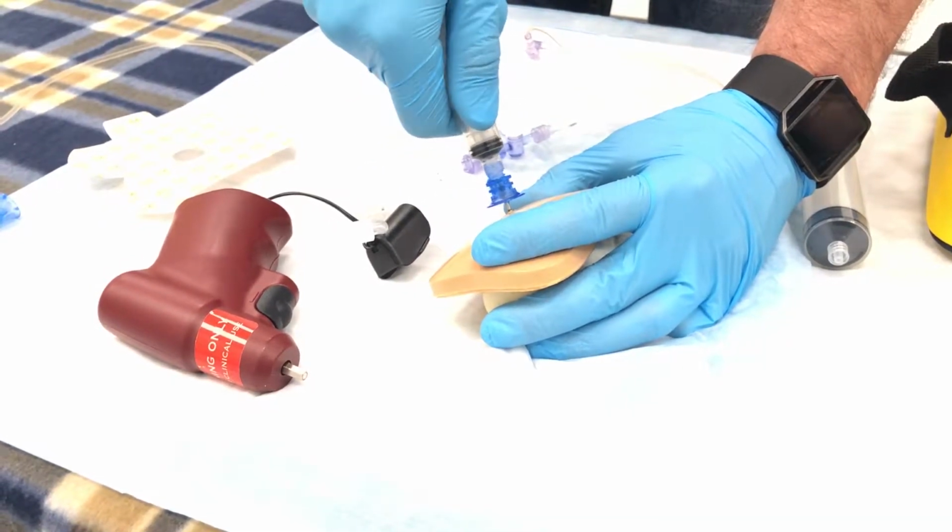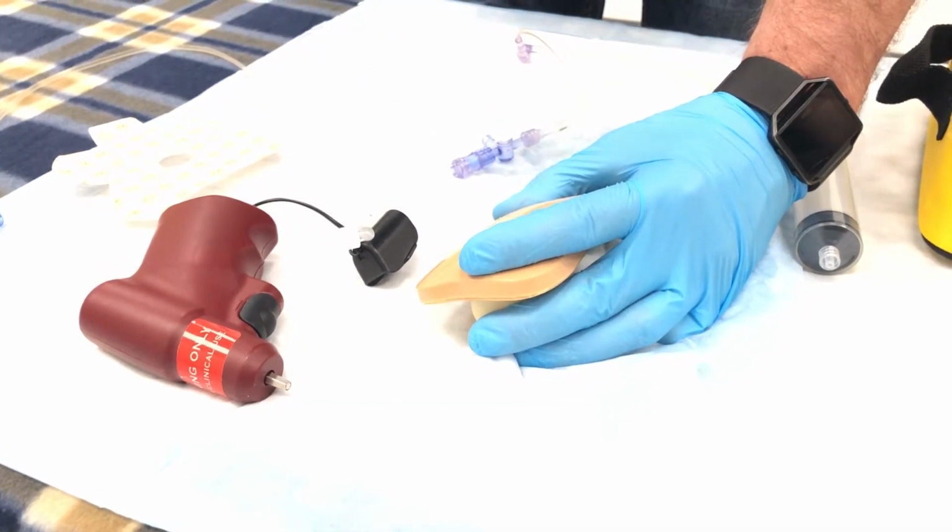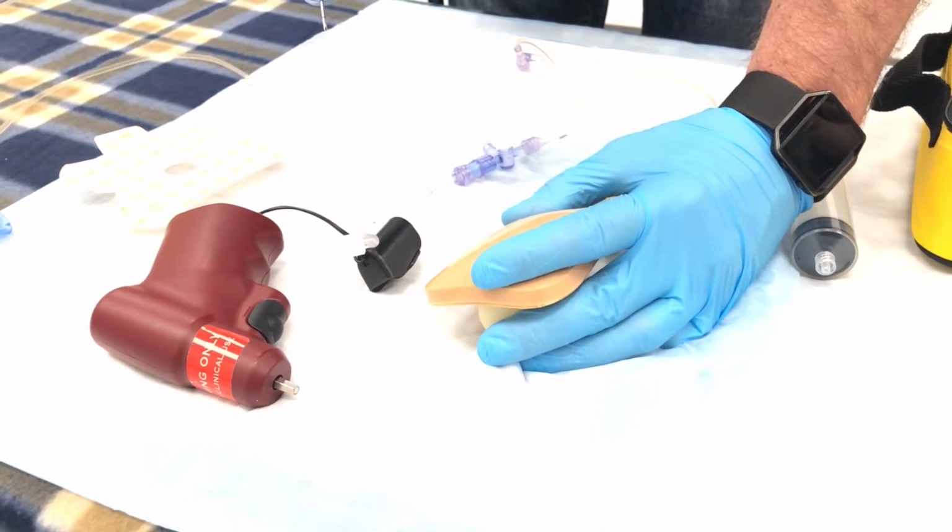Once removed, immediately place syringe and catheter in appropriate sharps container and dress site per institutional policy or procedure.